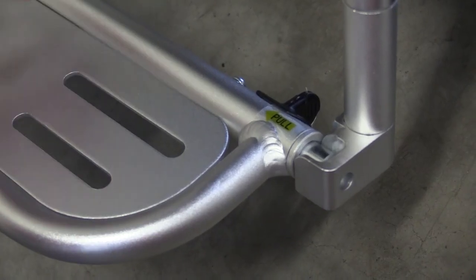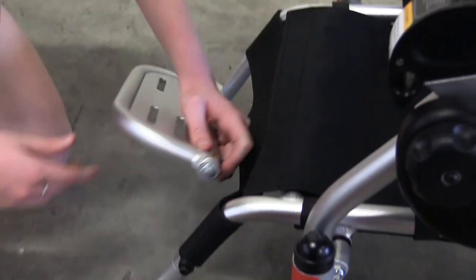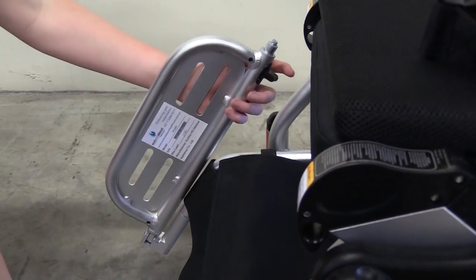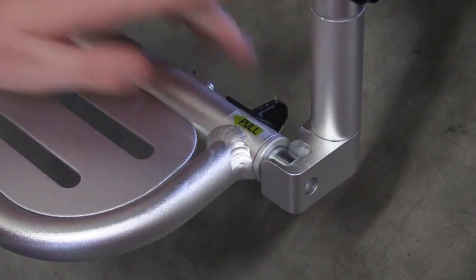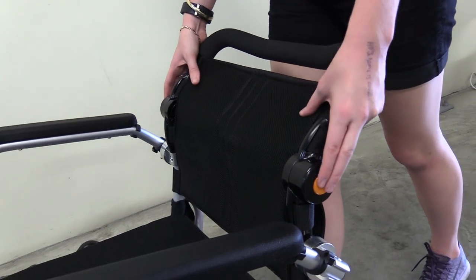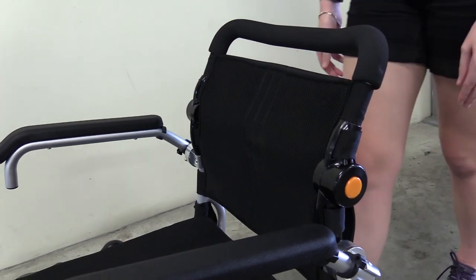To lift your foot plate, pull the knob and lift it up — this is helpful when getting out of your wheelchair. To put it back in position, simply lower the plate and reinsert the knob. To adjust your backrest, push both buttons simultaneously and adjust your seat to the desired height.